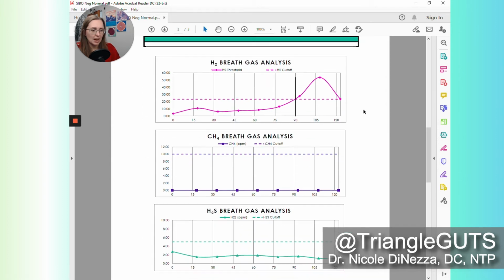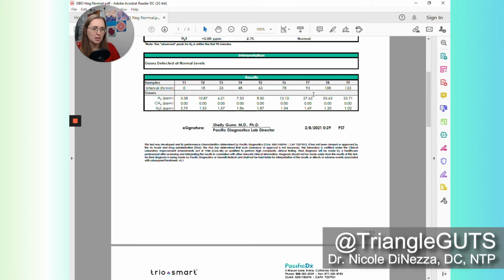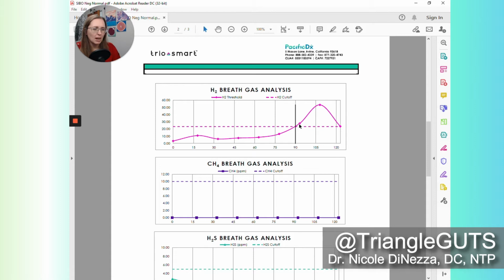And you can see this is actually a perfectly normal negative SIBO breath test. You can see that the bacterial fermentation, the hydrogen level, stays well below 20 parts per million right up until about the 90-minute mark. You can see that this person did their 90-minute sample at, it looks like, 93 minutes. So they did one at 78 and one at 93. And you can see that right there, they were just barely passing the 20 parts per million threshold.